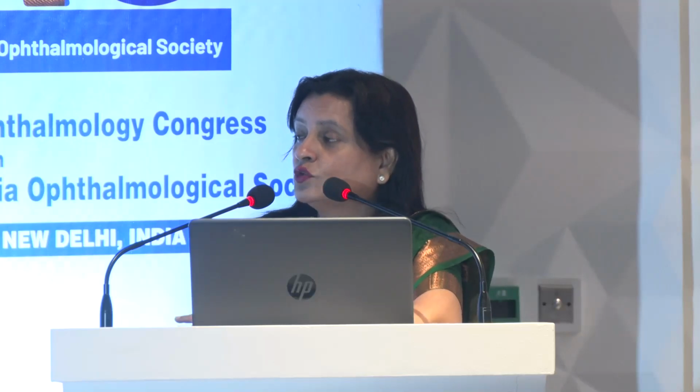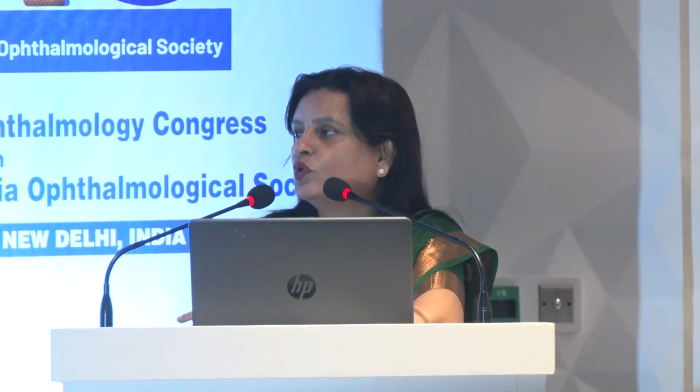So I would still go in for a toric IOL, but regarding the multifocal IOL, I don't think I will use it, because you have a multifocal IOL and then you have almost a multifocal cornea, so you don't know how it is going to behave. Extended depth of focus lenses I have started to use in these cases. I have not done a study to compare monofocal and EDOF, but on an extrapolation that they wouldn't decrease contrast sensitivity, I have started using them, but I do not use multifocal in these cases at all.